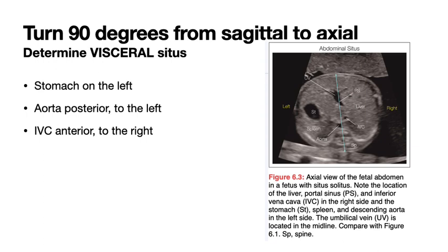That's the real thing. So you see the midline, and the aorta basically sits right on the vertebral body there, and it is slightly to the left. So by the time it's at the upper abdomen, that's where it is, slightly to the baby's left. And the inferior vena cava is to the right, and it is anterior, well away from the vertebral body.